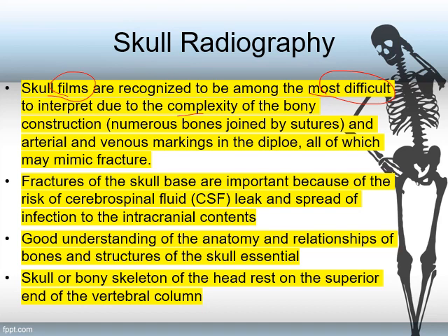So, yung mga radiographs niya, yung pictures niya, yung images niya, yung mga examinations niya, medyo mahirap siyang i-interpret because of the so many complex anatomy that are inside the skull. So the term diplo, we will discuss that on the succeeding slides later. So these markings, including the bones, the joints, the sutures, the arteries, the veins, may mimic fracture.